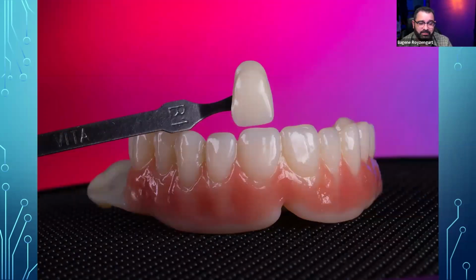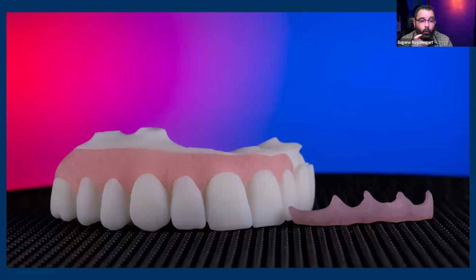As you can see, the shade matching is pretty good. I mean, I've been really pleased with it. Okay, another way I've tried doing it, this is more recent. I actually printed this prototype out of the Titan. And guys, Titan has been good. I've had this stuff in the mouth for 4+ months, and it looks really well.